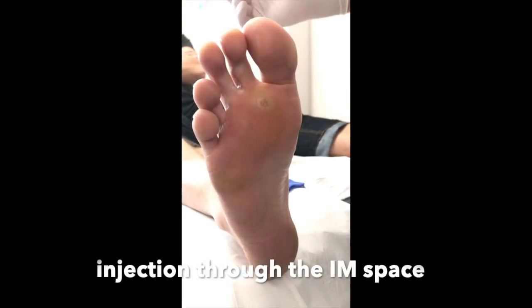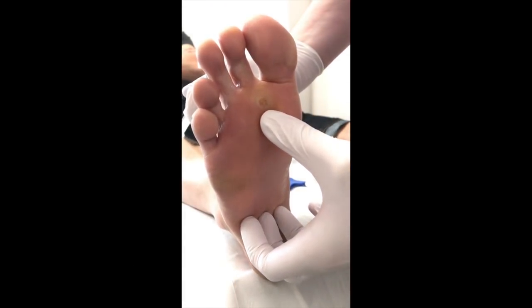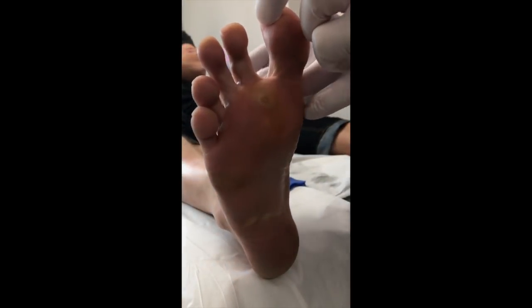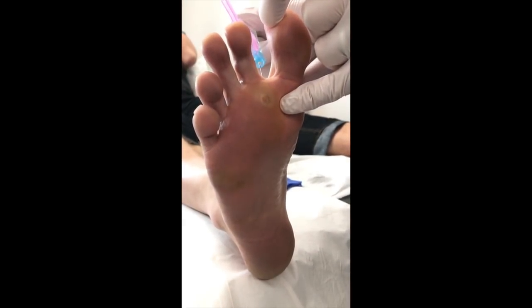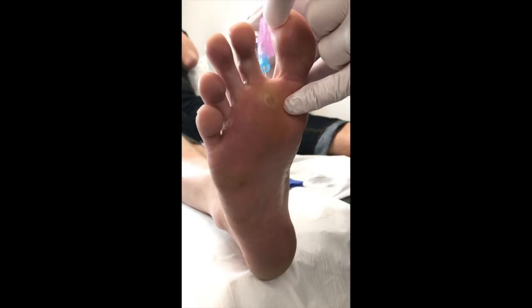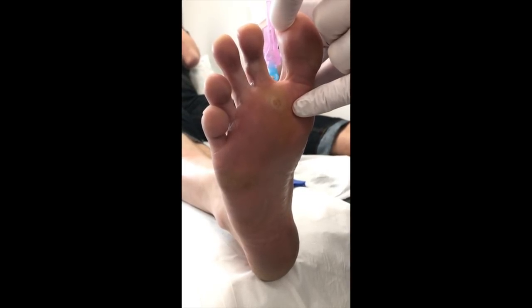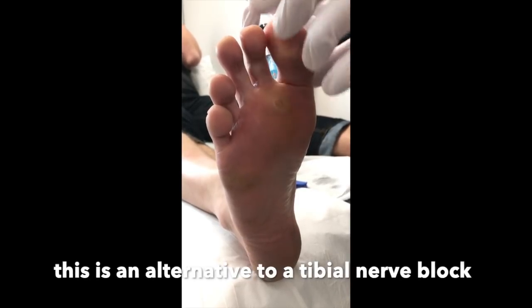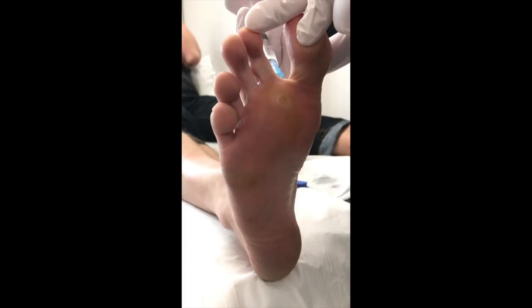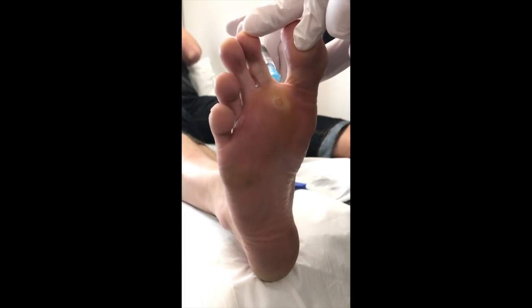So Nick, I'm just going to stand up — there's our verruca, right underneath the second toe. Nick, I'm going to come in from the side — three, two, one, scratch. I'm just going to gently advance the needle. If I go deep down you will feel a little bit of a stinging sensation underneath the foot, it will just sting a little as it goes in.